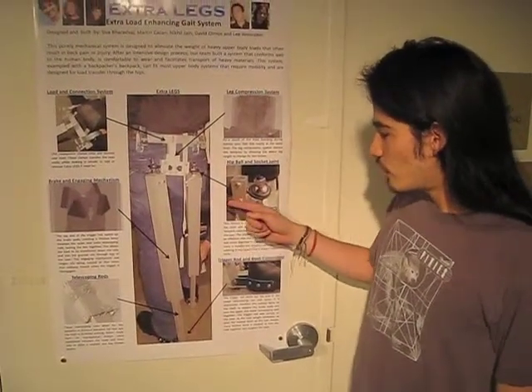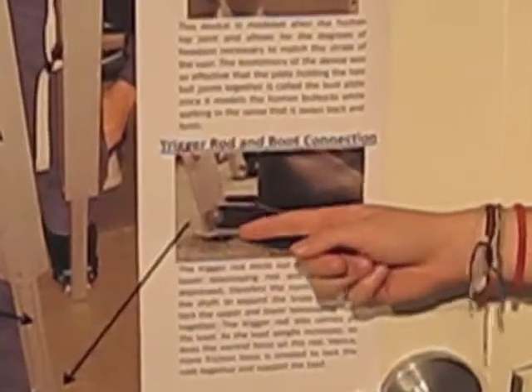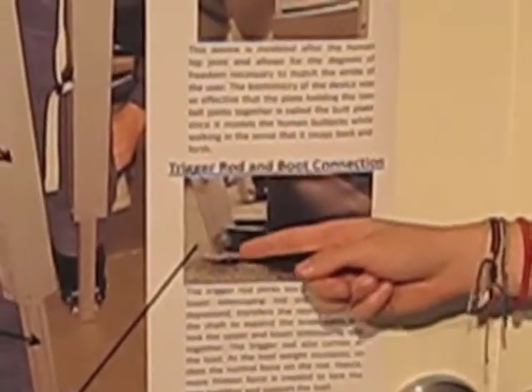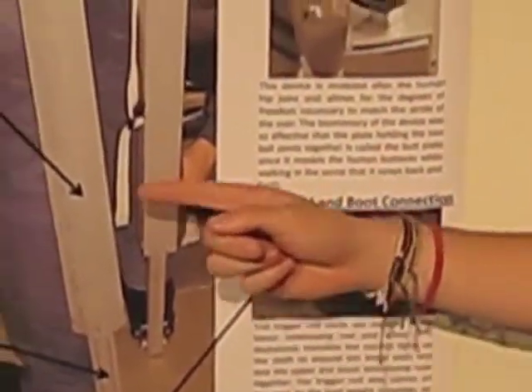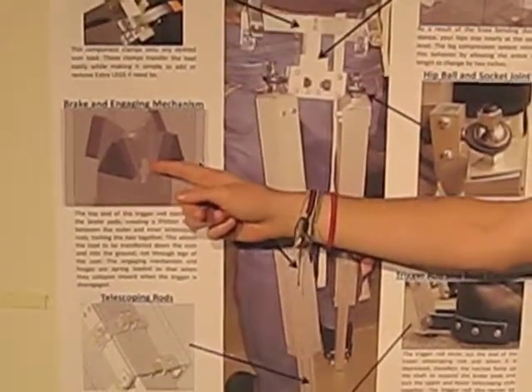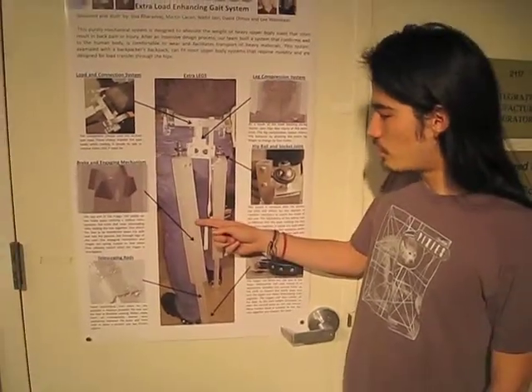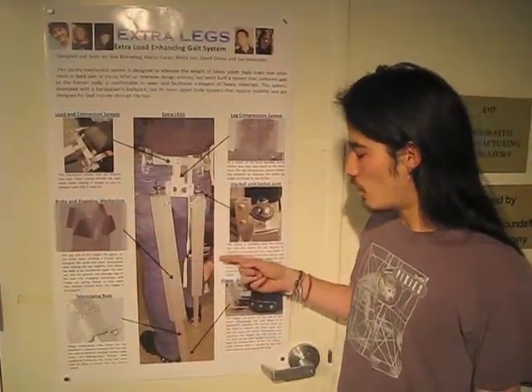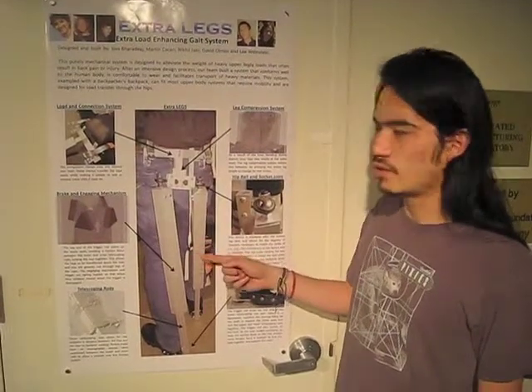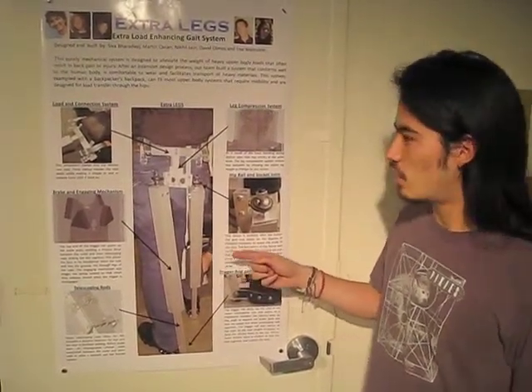Specifically, the way this works is there's a trigger rod located in the heel of the boot. When it's pushed up, it engages a brake inside the trigger rod. This way, when the user's foot is down, the telescoping rod locks and becomes weight-bearing, while once the foot is lifted off the ground, the telescoping rod is free to move and the user can walk.